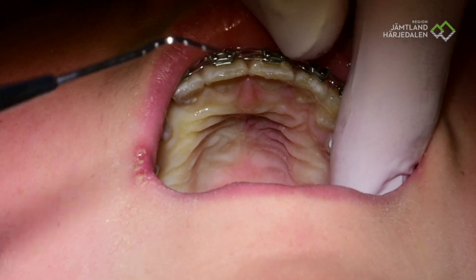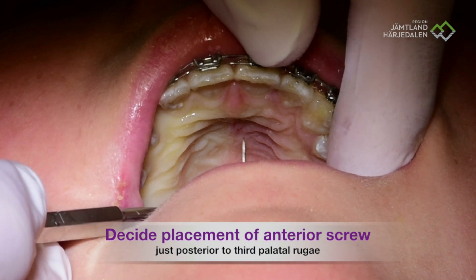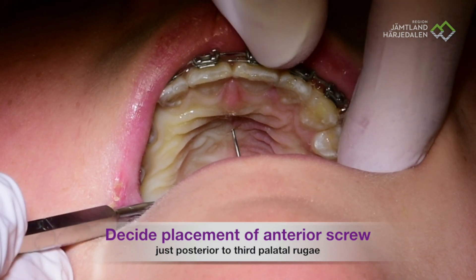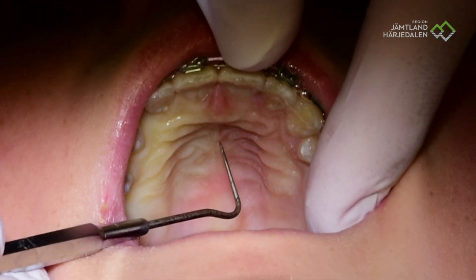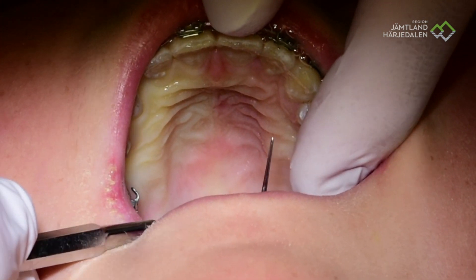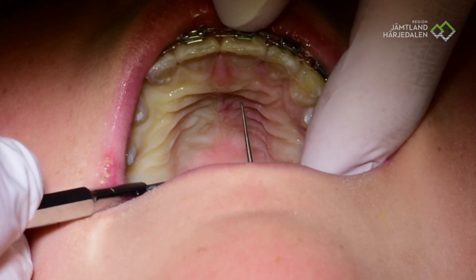It is very important now to see the mucosa. I am counting the ruges: number one, number two, number three. Just beside or distal to number three, I am checking the mucosa. It is very thin mucosa — it has to be no more than two millimeters. Never ever. If it is thicker than two millimeters, then we have to move distally in order to get thinner mucosa.